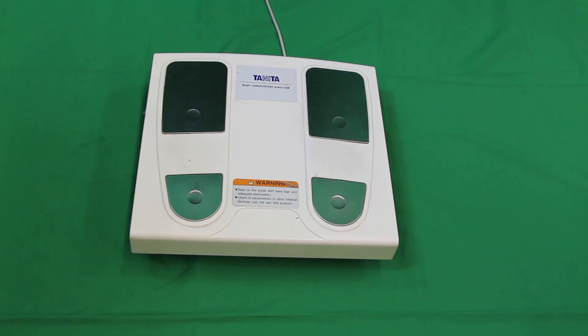This is what the foot plate looks like on the Tanita system. You can see there is clearly a left and right foot spot, and you just want to make sure that the foot lines up with those two spots. Before and after each use, you also want to make sure that you're using some sort of alcohol swab to clean the system.